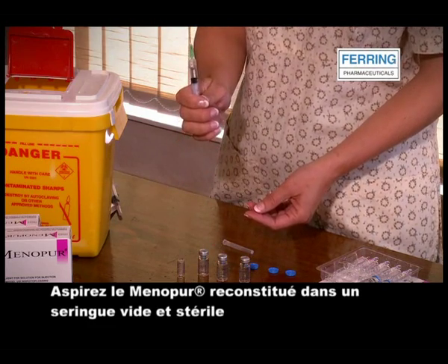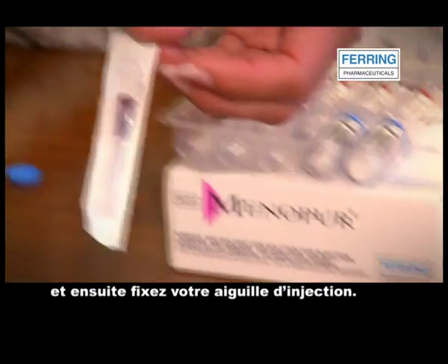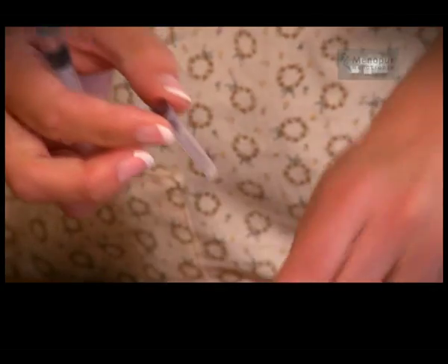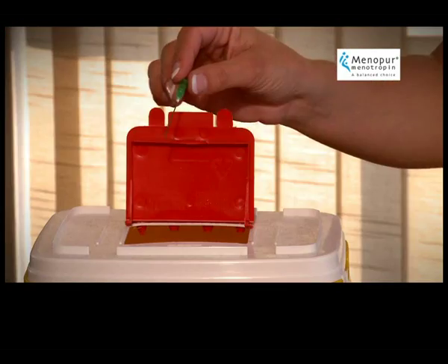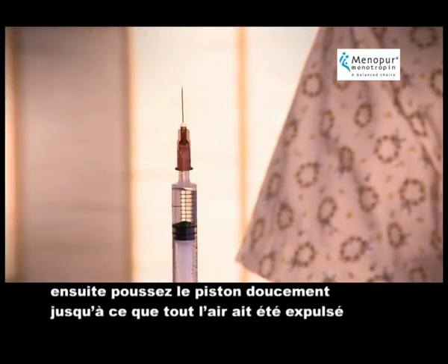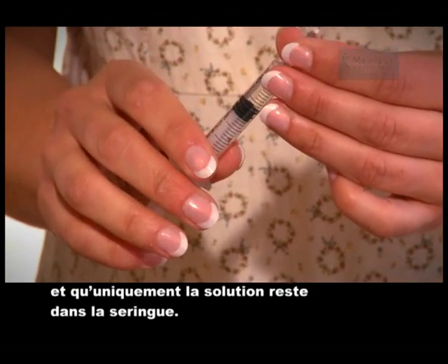Draw the reconstituted Menopur into an empty, sterile syringe with your mixing needle and then put on your injecting needle. Hold the syringe pointing upwards, then squeeze the plunger gently until all the air has been expelled and only Menopur solution is left in the syringe.